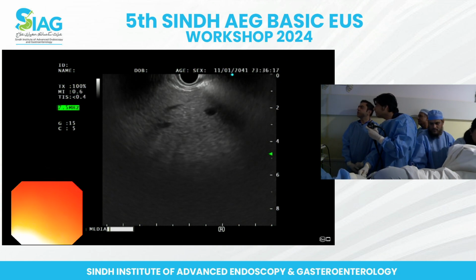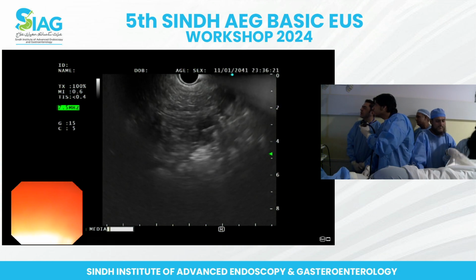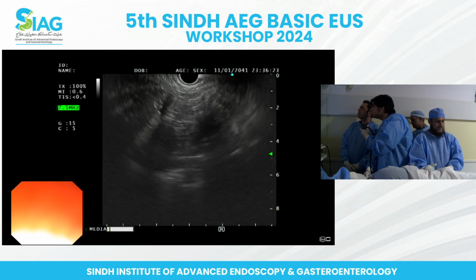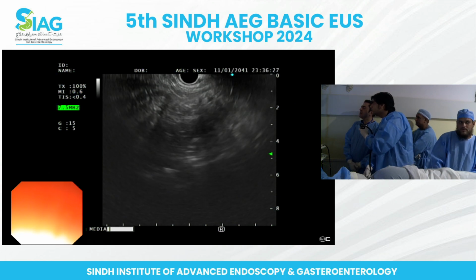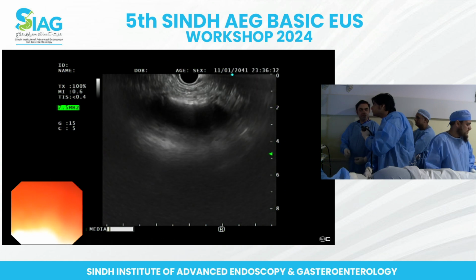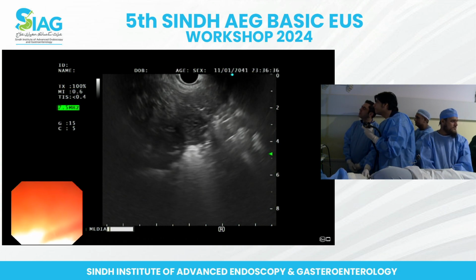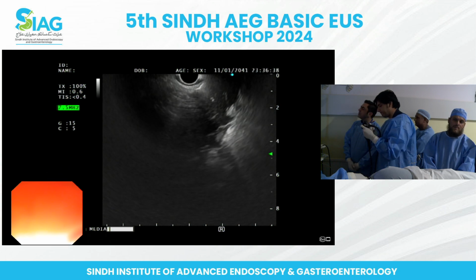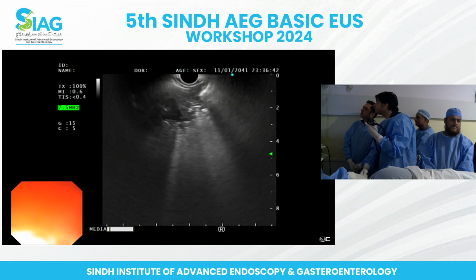जिस तरह बच्चा गुम जाता है ना तो सीधा घर आता है, तो ये जो घर है ना GOJ के ऊपर, वो आपका aorta है। तो कहीं भी आप if you get lost, so you just need to run back to the aorta, and that will give you the confidence to do a more dynamic study. So okay, apply a bit of suction. आपके जो little wheel है, इसमें lock तो नहीं है ना, देखिएगा। No, okay, that's fine. Okay, excellent.